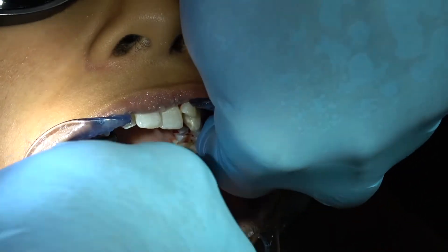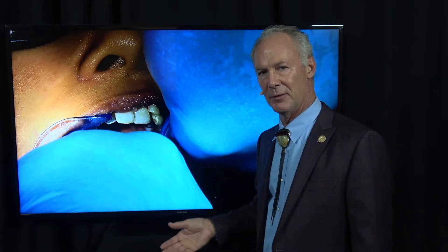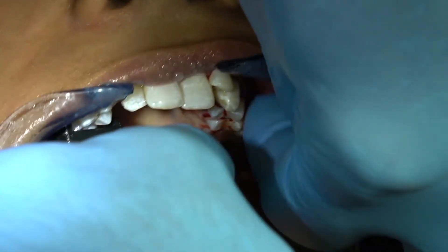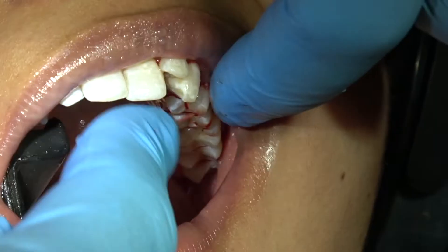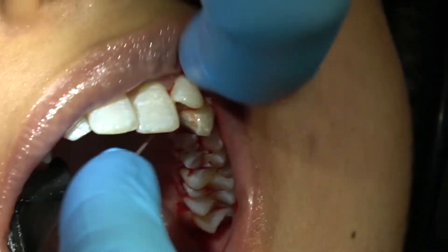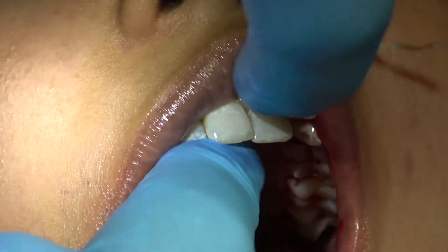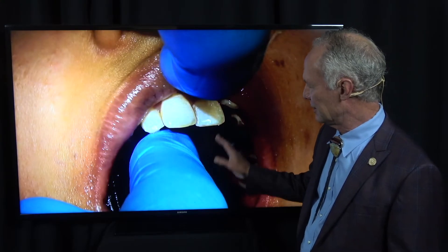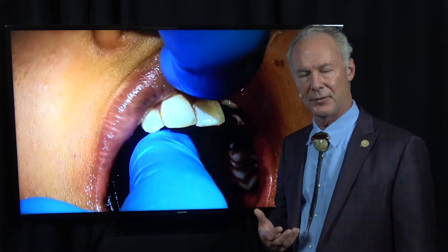How soon do they come back? I like the patient to have the second appointment for fine scaling, polishing, and oral hygiene instruction within a week of this initial gross debridement appointment. I'm now flossing, making sure all the little bits of calculus and plaque are off the teeth. There will probably be some fairly significant bleeding because those gums are irritated from the calculus and plaque — and if a patient has this much buildup, they probably don't floss their teeth.